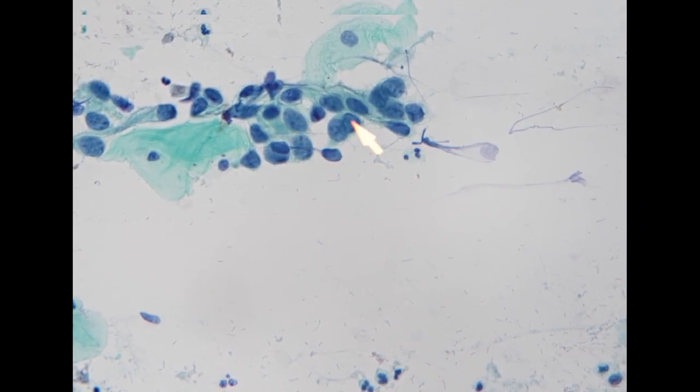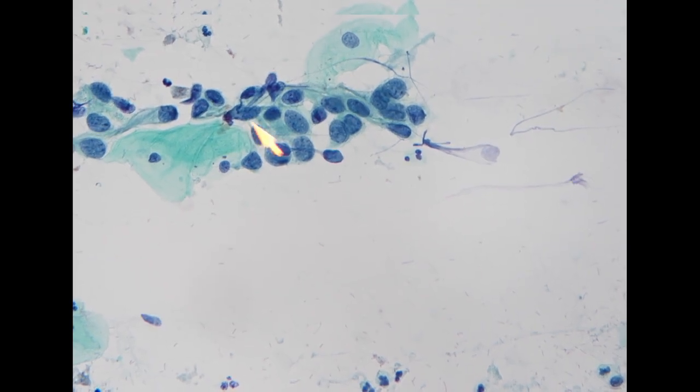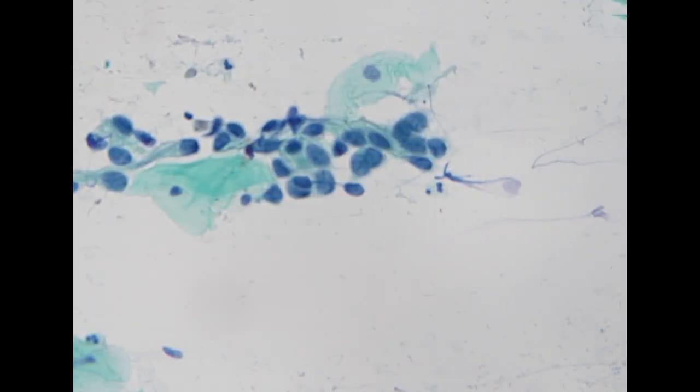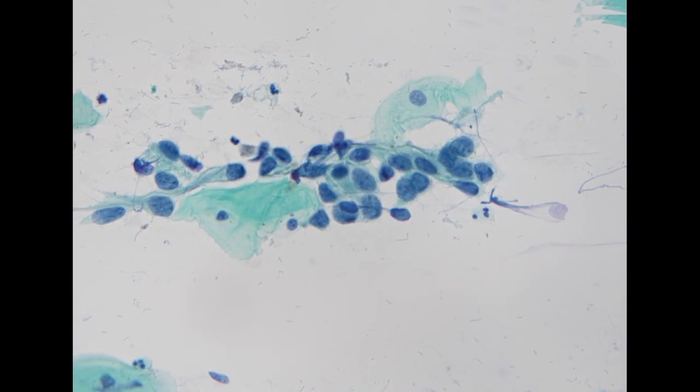The nuclear chromatin pattern is not particularly coarse, but there is the hyperchromatic pattern and a high NC ratio. So this is a very good focus of high-grade lesion. For this case, we are going to call this high-grade.